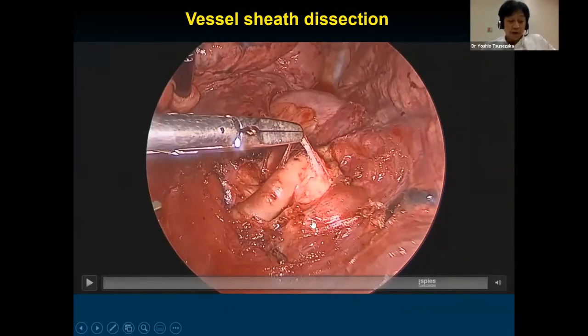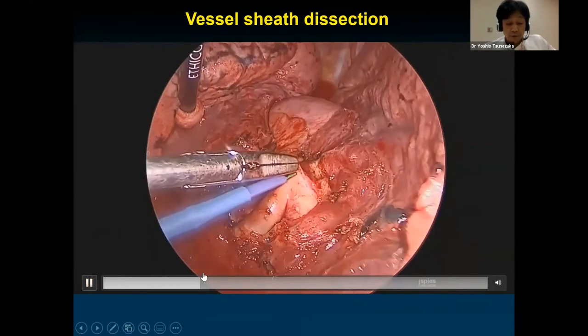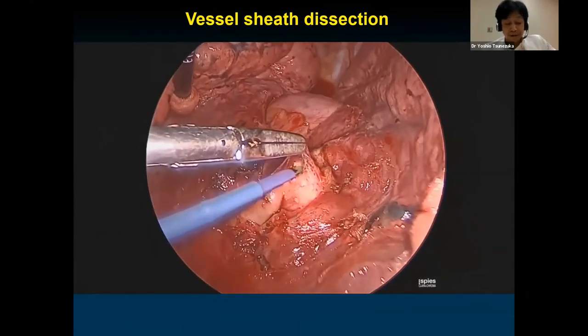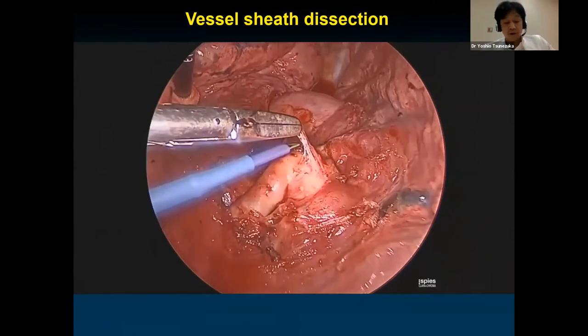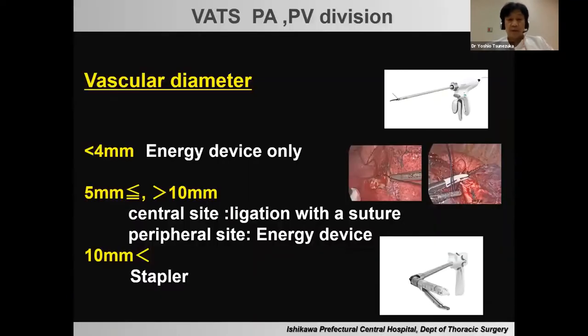There are many sheaths like layers of onion skins. Maybe this particular technique is unique only to Japan because all surgeons are educated that this procedure is essential for division of the vessel. Therefore, I guess that the treated pulmonary artery is more fragile than that of other countries.